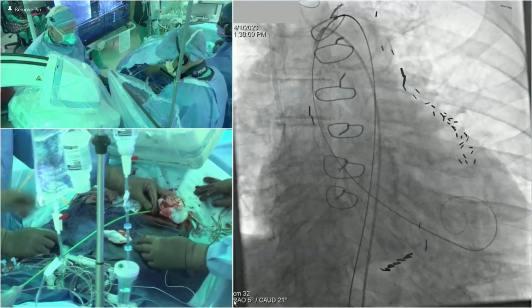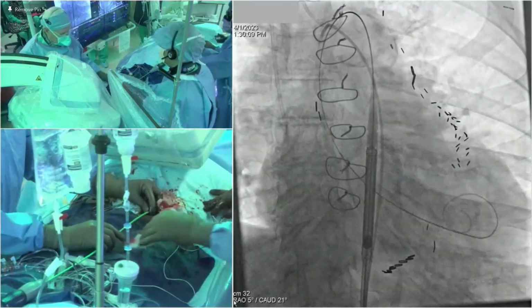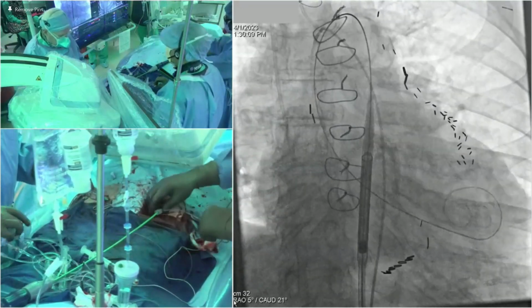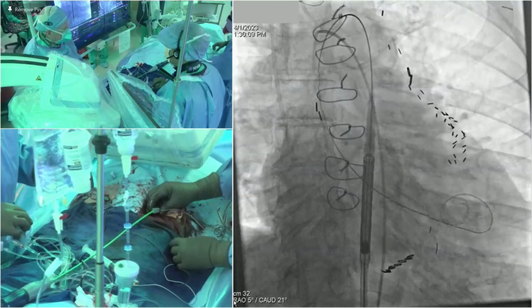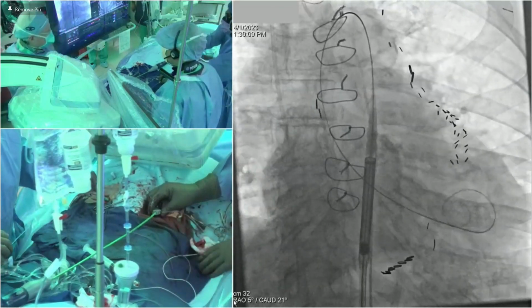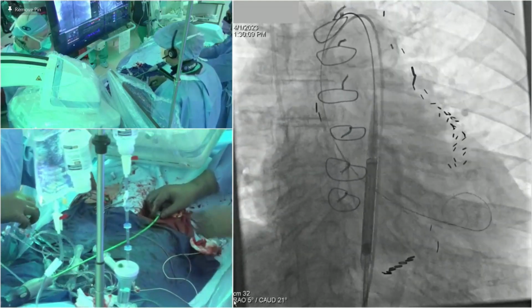But this gives you the lowest thresholds. Otherwise, just put a needle through the skin or the incision that we make for the TAVR sheath. You can just clip the alligator clips right on there. So three ways to ground. You can also just pin it to the sentinel wire. You could ground anyway. It doesn't make a big difference.